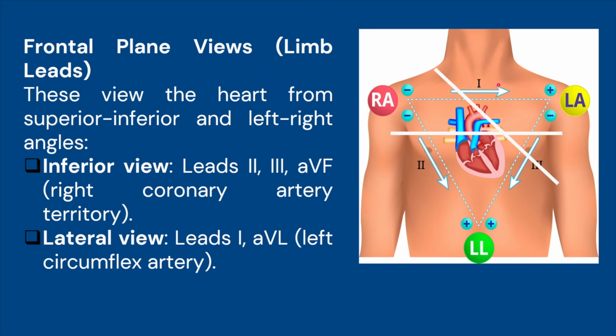So clinically, if you have ST elevation in leads 1 and aVL, it can indicate lateral infarction. If ST elevation is in leads 2, 3, and aVF, it can indicate inferior myocardial infarction.